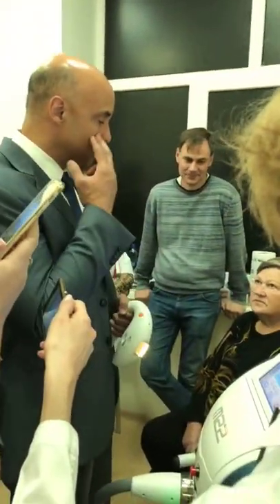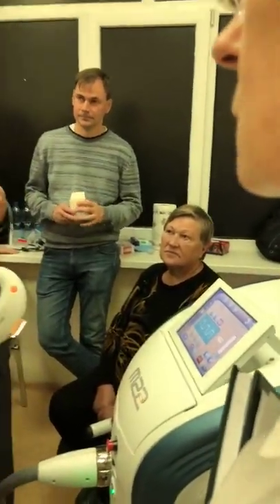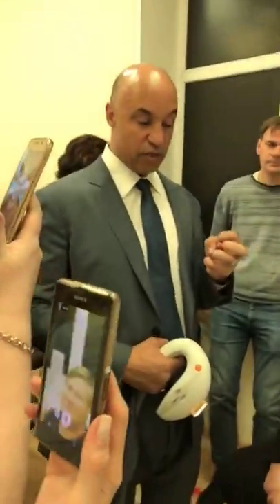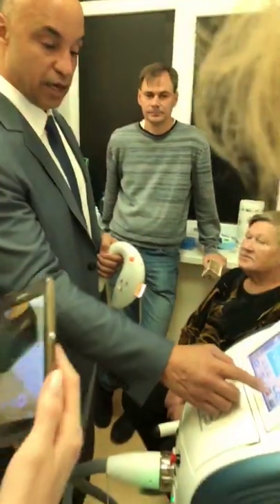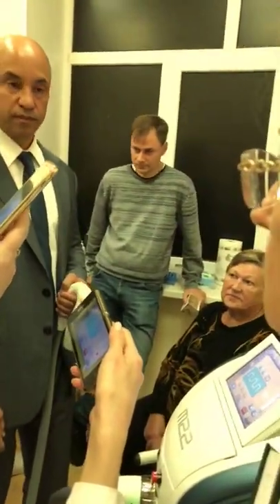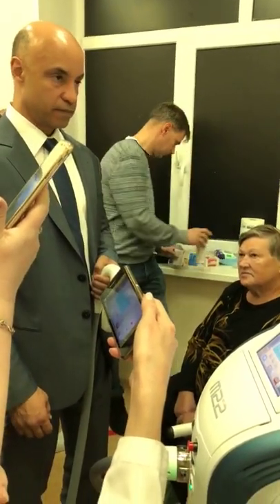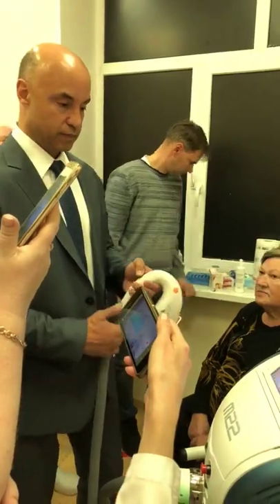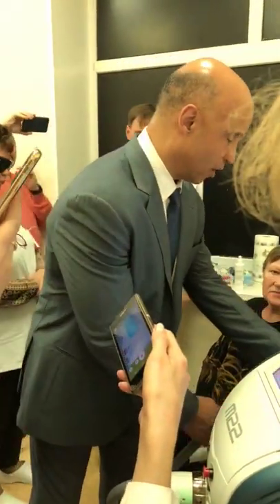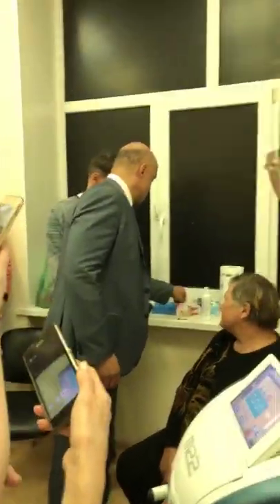So with her skin, you see she's got some pigment in her skin, little spots of pigment. So she's going to be absorbing more energy in those areas of pigment. So we're going to give her 13. Okay. All right. So we're going to go ahead and use these.